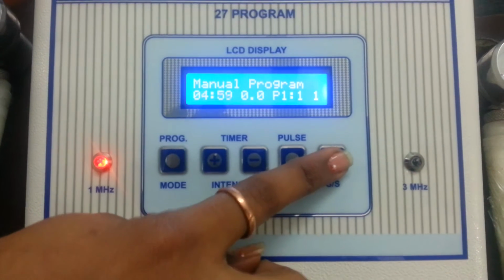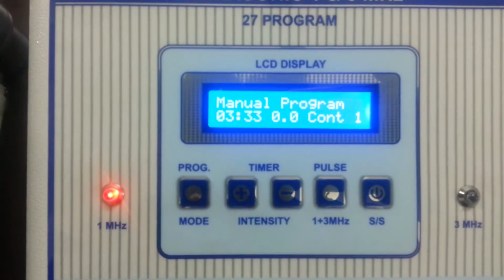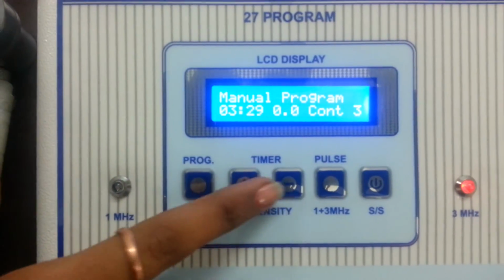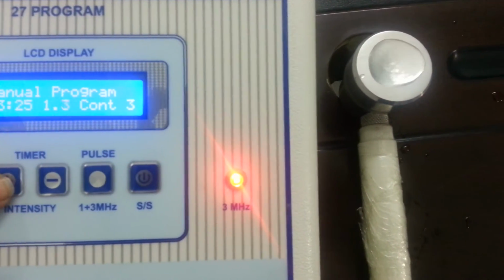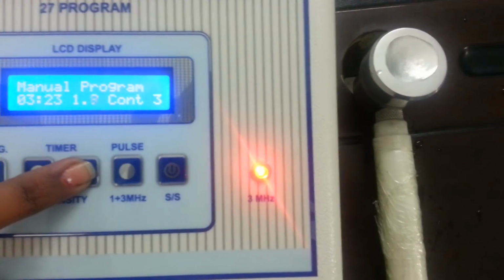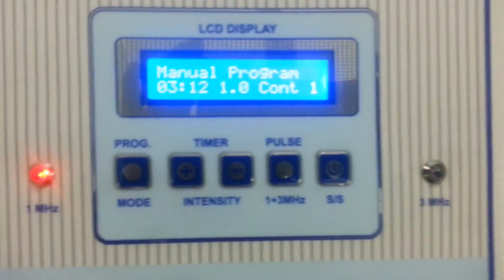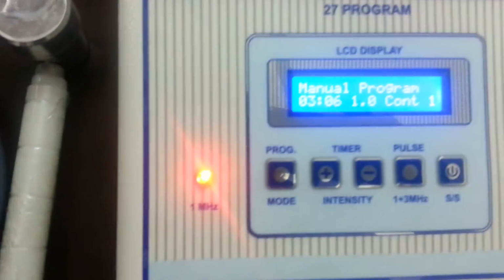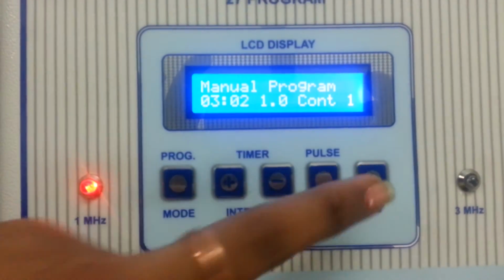Start the machine. You can change the current from 1 to 3 MHz by pressing here. Now increase the intensity as per your need. Intensity up, intensity down. After treatment is completed, stop the machine.